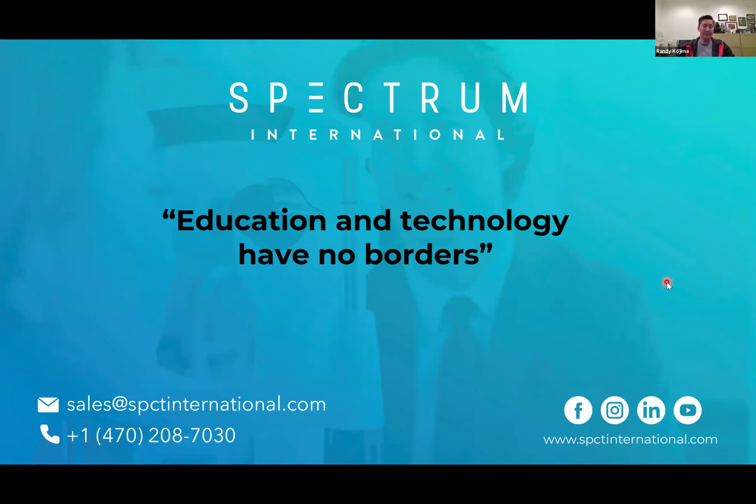Well, there's some designs that have been made quite thin in Ortho-K, and it seems to be working okay with thin lens designs, but I follow John Mountford, the guy who wrote the textbook on Ortho-K, and it's his feeling that the Ortho-K lens needs to be thicker rather than thinner.